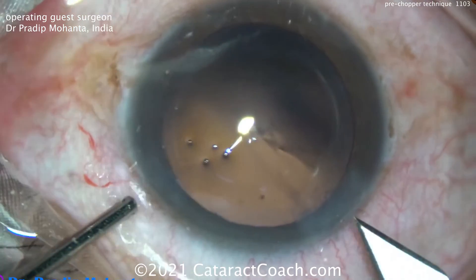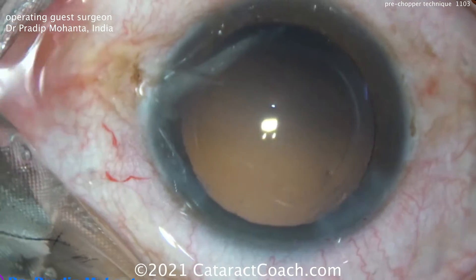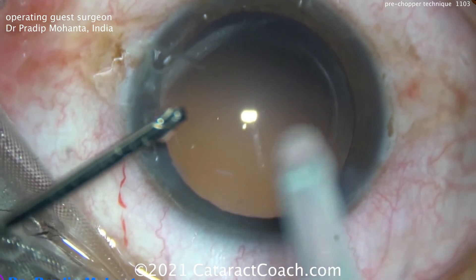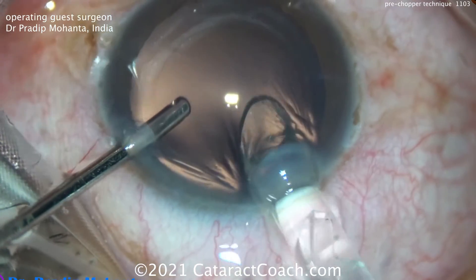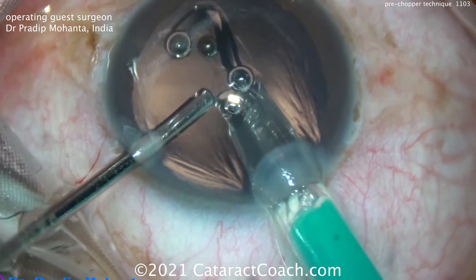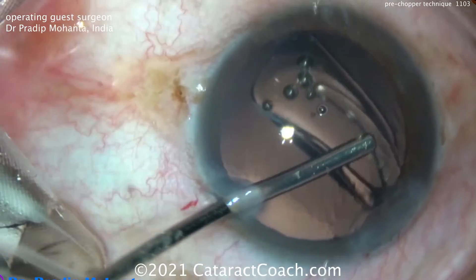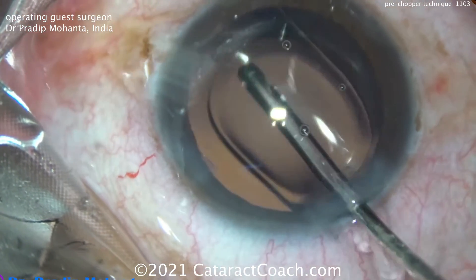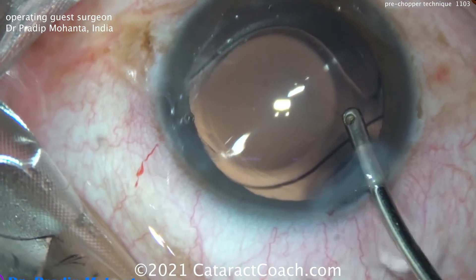I wanted to show you this case — it's always fun to watch Dr. Mohanta operate. He's a very skilled surgeon. He's going to now inflate the eye with the irrigator and then enlarge the incision a little bit. Let's see what type of lens we're going to put inside. International surgeons outside the U.S. will often have lens designs we don't have here. Looks like a single-piece acrylic lens. Leading haptic coming out nicely, there's the optic, and there's the trailing haptic — going right in the capsular bag. A single-piece acrylic monofocal lens. Getting it positioned nicely, and the case is basically over.